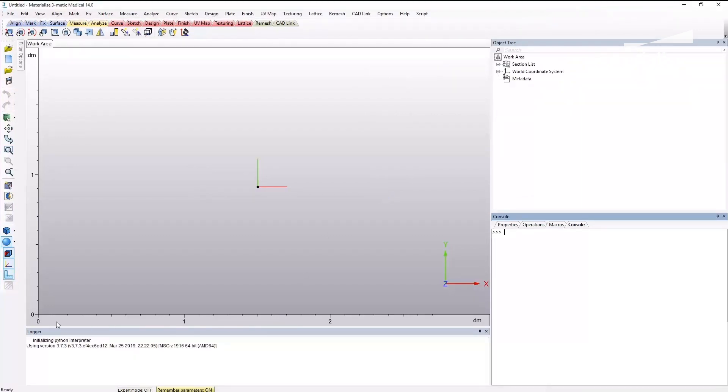In the logger, you can see that the settings have become active. Now, you are all set up to start scripting with 3-matic.